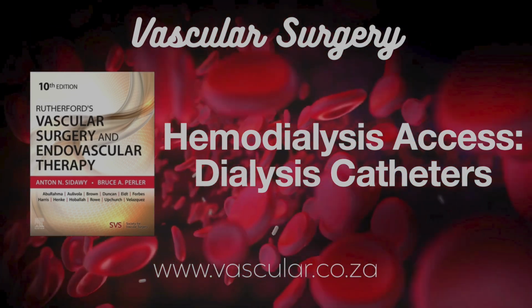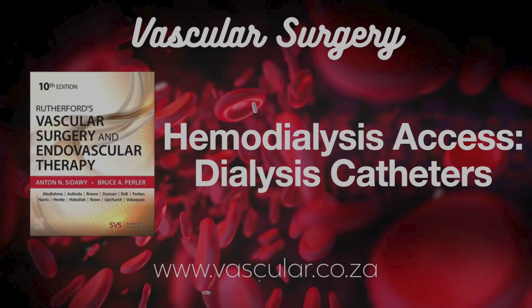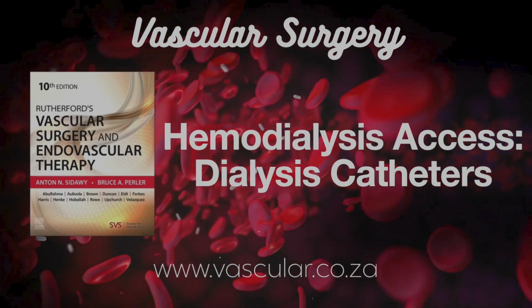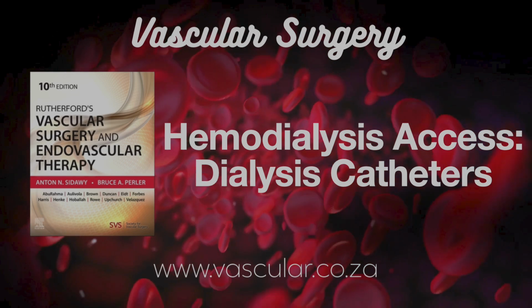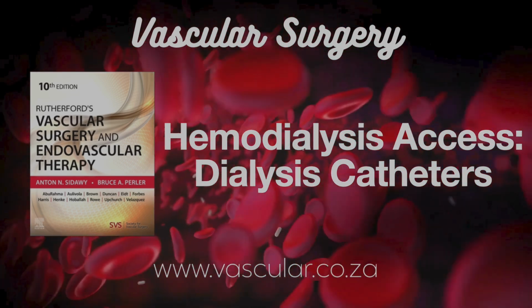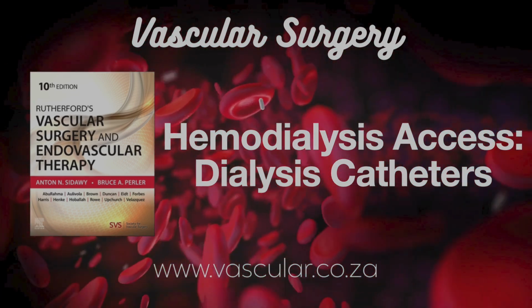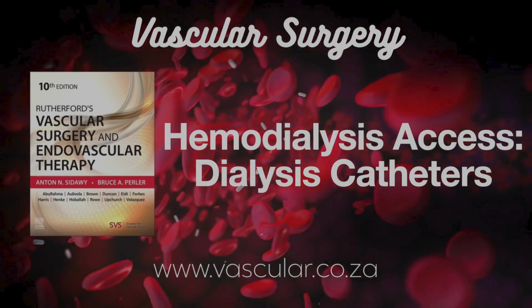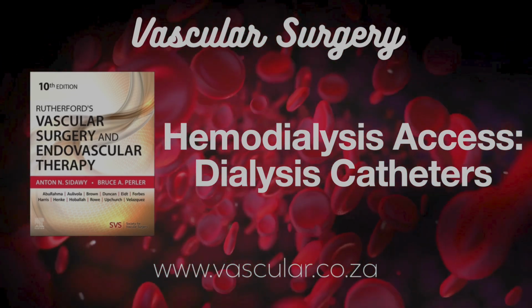Other options are mechanically stripping the fibrin sheath with a snare from another access point, or doing a catheter exchange over a wire, maybe ballooning the sheath first. But reviews suggest these complex maneuvers don't necessarily keep the catheter working longer than just a simple exchange. So often just replacing the catheter is the answer. Frequently, yes. If it's not infected, you can sometimes replace it over a wire through the same tunnel, which is less invasive than starting all over at a new site.